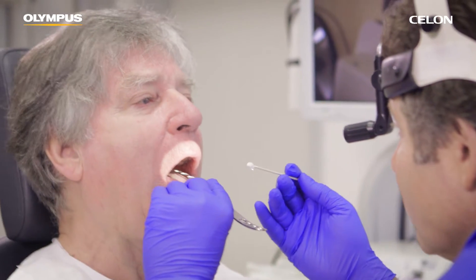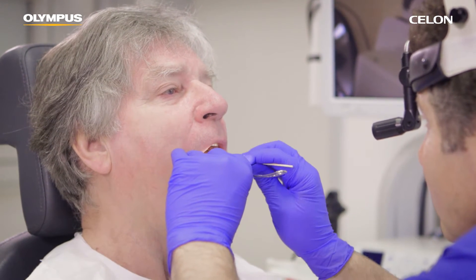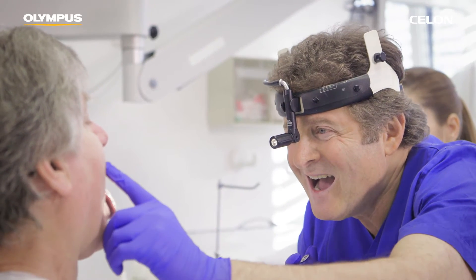Apply a topical anesthetic like lidocaine gel or spray to the palate and uvula of your patient to counteract their gag reflex and reduce the pain of the injections.